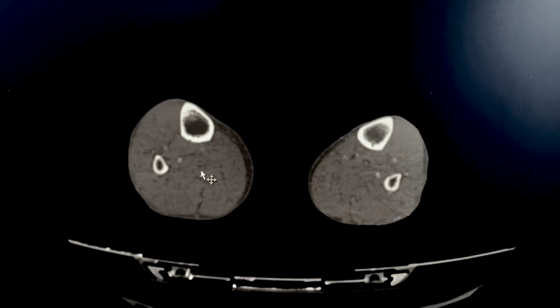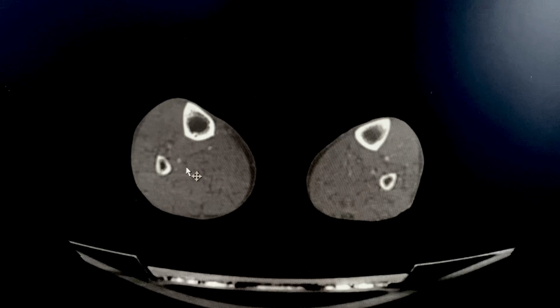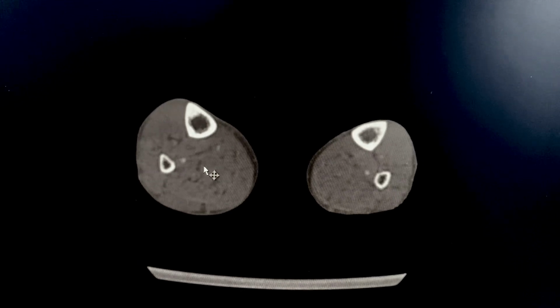As you continue down, the posterior tibial artery as well as the peroneal remain open, but then they eventually keep giving off some branches here and there.